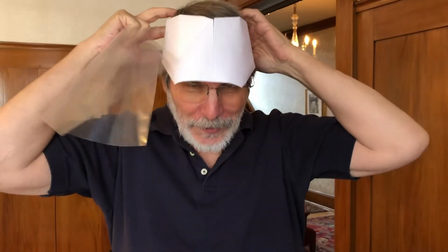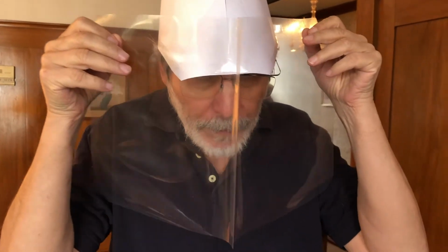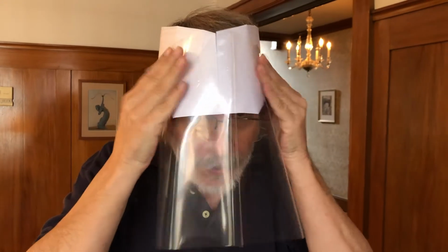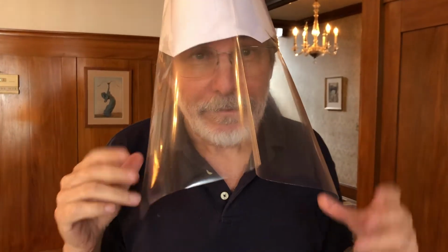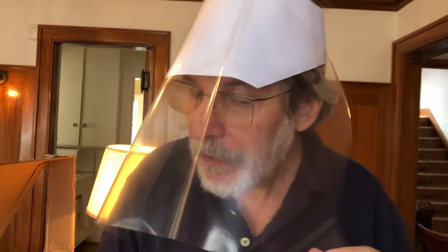Okay. All right, so here we are. And one feature of this design, by intention, is that you actually want to leave a little bit of air here and here. But it turns out, even wearing it and even without a mirror, you can say that feels about right on my little head. And then you can press against the temples. And there you are. Now, there are all sorts of things you can do down here. First of all, you can leave it like this. But if you don't like the flappy or you want a little more structure, even as you're wearing it, you can say, I'm just going to put a little bit of tape on the interior of this corner.